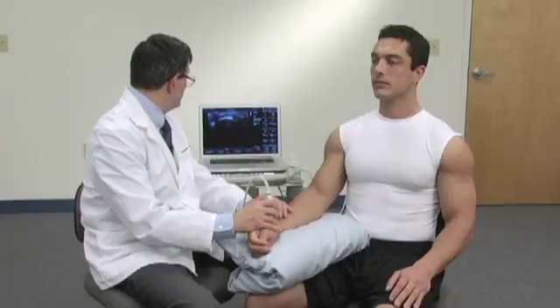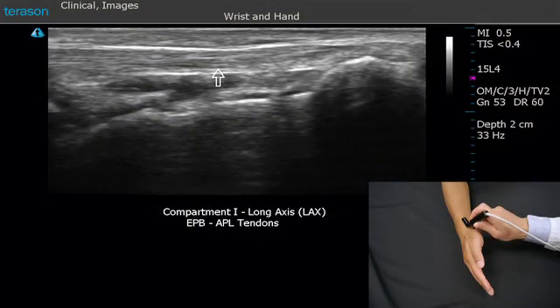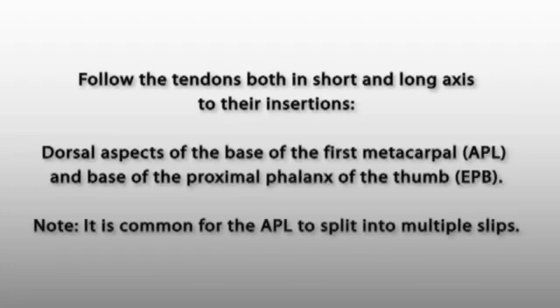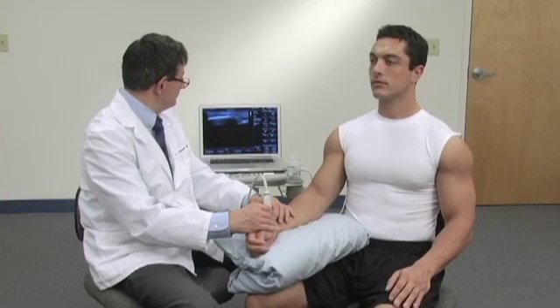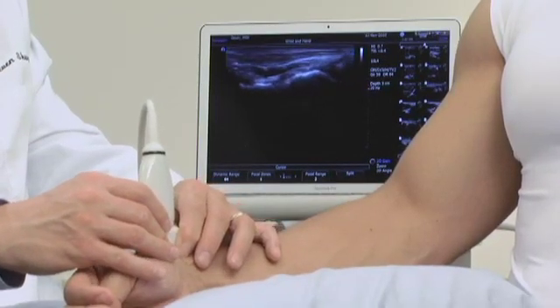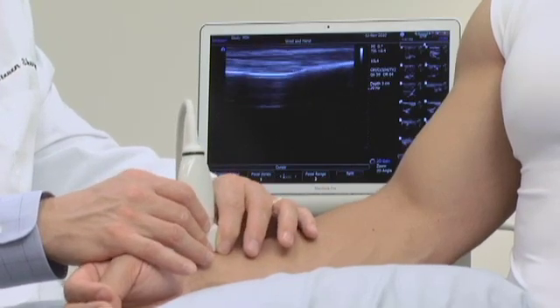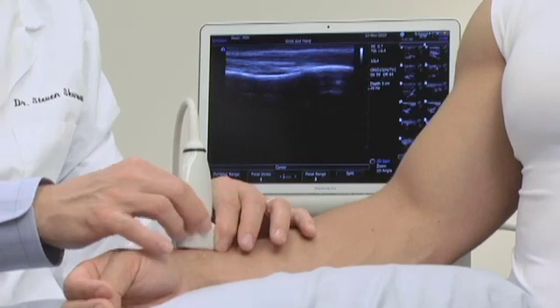Now I'm going to turn the probe 90 degrees to look at the tendons in their long axis. We can follow those tendons distally towards their insertions and proximally towards the myotendinous junction, both in long and short axis.